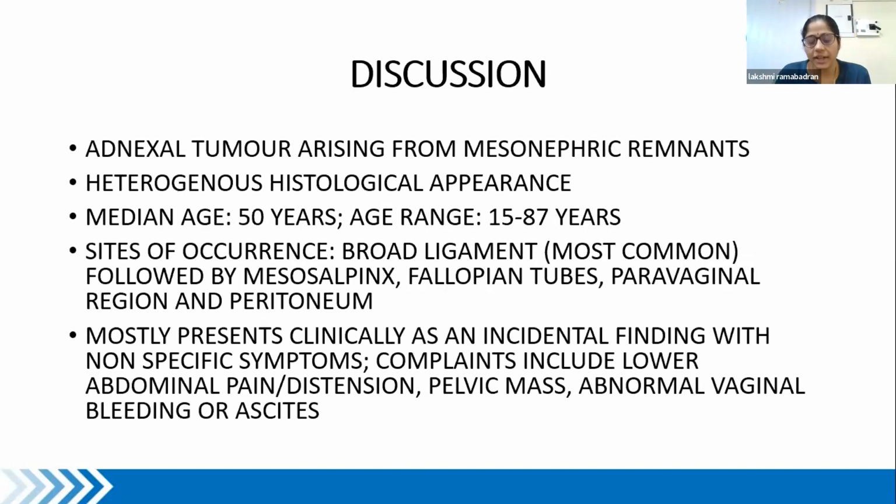It has a very wide range. Other people have also ventured to give their thoughts. We have Dr. Divya, who called it endometrial stromal sarcoma. We have Dr. Malini, who called it FATWO. We have Dr. Supriya Jain, who called it mesonephric remnant. Very nice. Everybody has come close, because this tumor actually arises from the mesonephric remnants, madam.